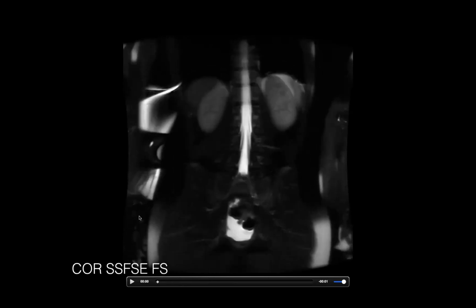Yep. And I'm not fully sure exactly what the full source of this artifact is here. I think there's probably something more going on. It looks like fat suppression that failed somehow, I guess. Maybe also with aliasing. Maybe the combination has produced this.